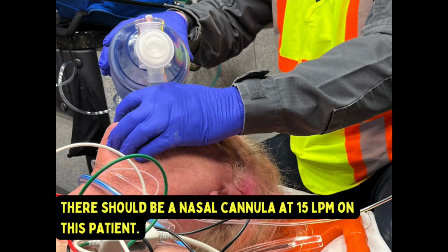Also, add a nasal cannula at 15 liters per minute. Yes, you heard that correctly. It greatly increases the amount of oxygen that is delivered to the lungs, and you keep it on the patient until the intubation is complete. Even if they are apneic, they are still getting oxygenated via passive oxygenation. And pro tip, you need to use a conventional nasal cannula to do this. You can't use an end-tidal nasal capnography device to do this.